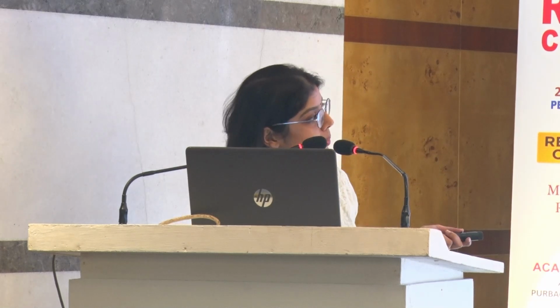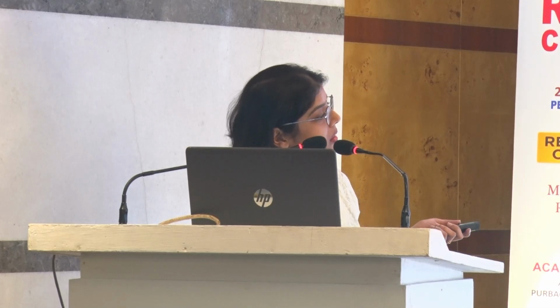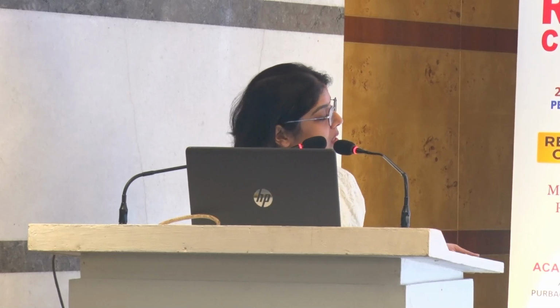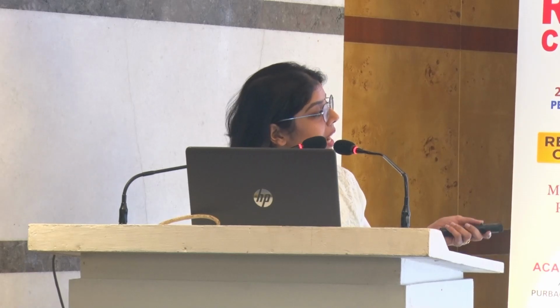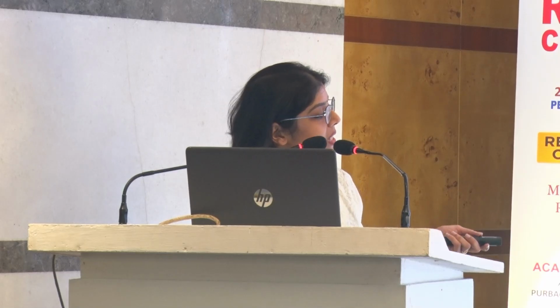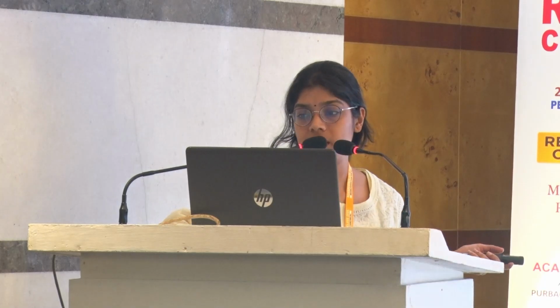So moving on to other pathologies. This is a longitudinal scan of the knee. This is the lower end of the femur. This is the left quadriceps tendon. We can see the probe placement over here. And there is a hypoechoic area right under the left quadriceps tendon. So this is basically a fluid, a suprapatellar bursitis in the left knee joint.